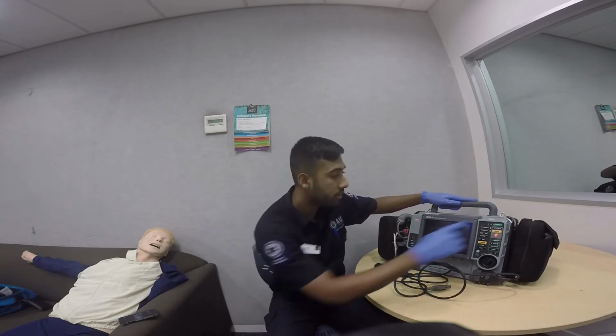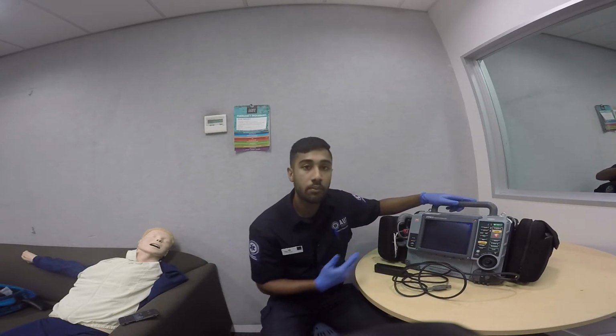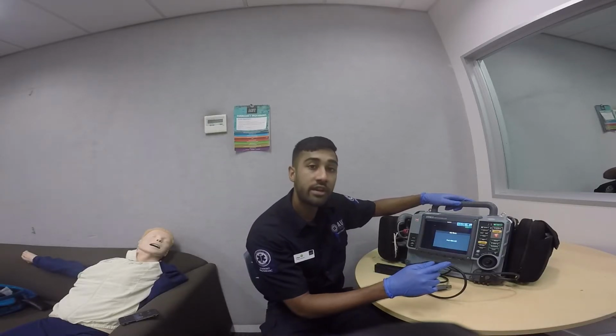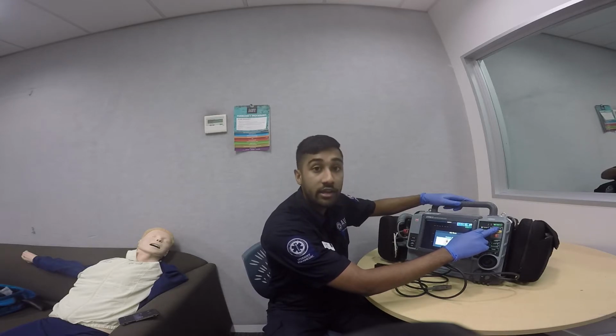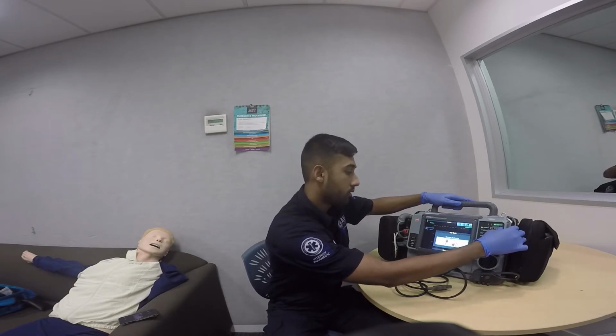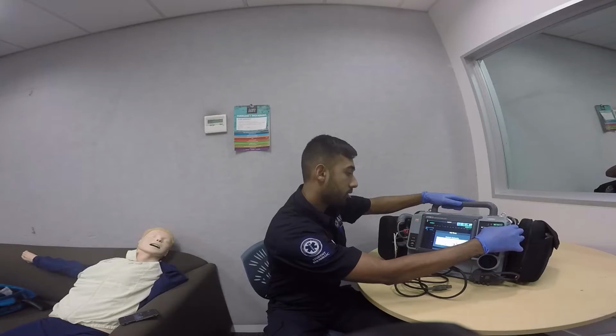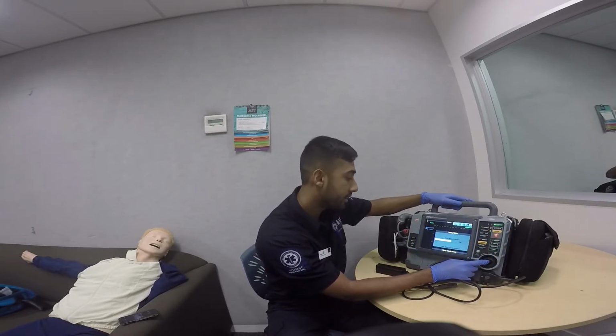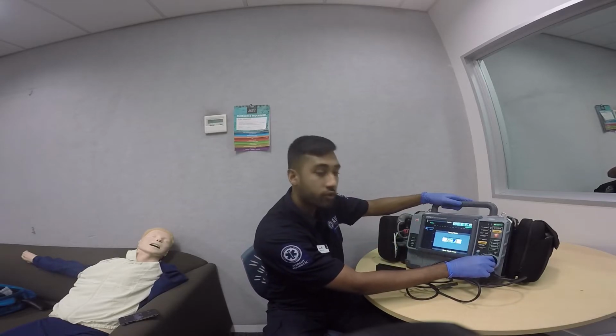To turn the LifePack on, you just hit the on button. It should start up in AED mode. So to change that, push analyze, we'll connect, hit energy, electrode select, and hit enter manual mode using the speed dial and hit yes, changing it to 50 joules.